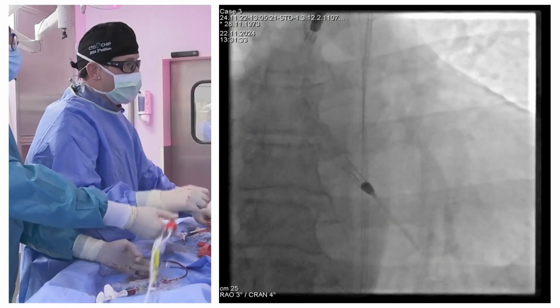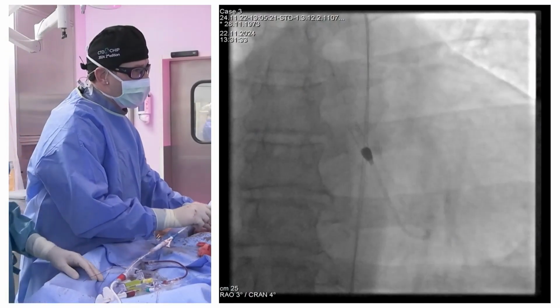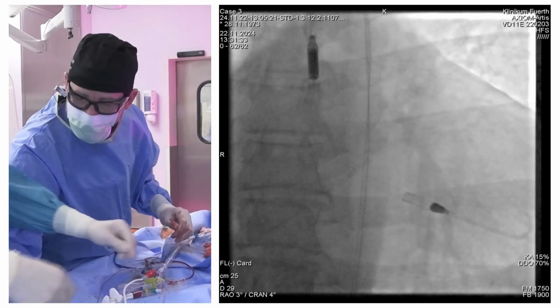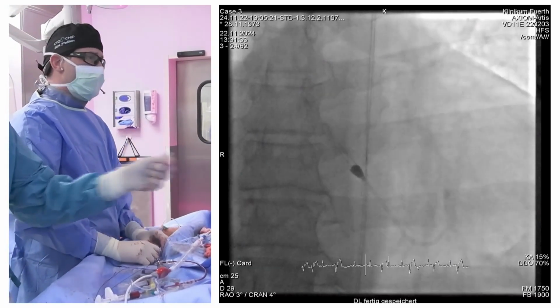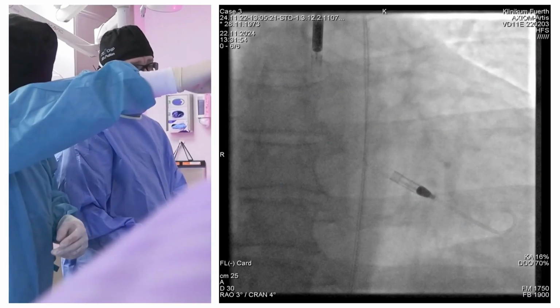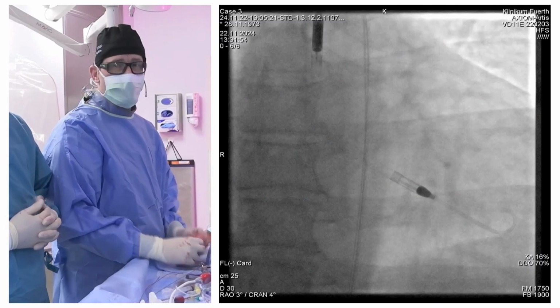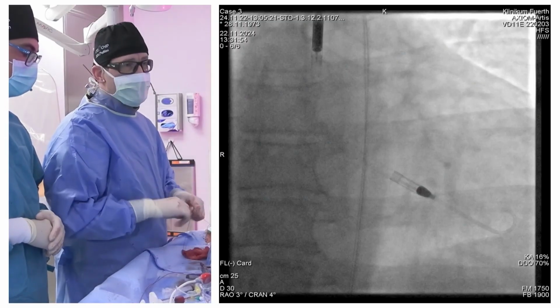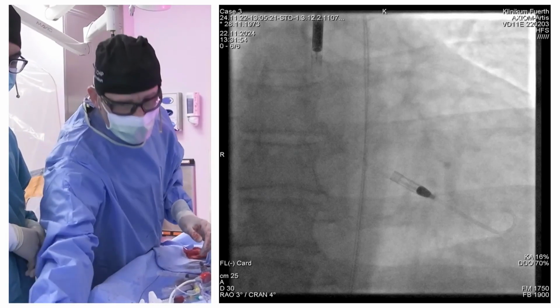Felix, have you heard this comment? Yeah, I heard that. What do you think about it? It's a matter of experience or also personal estimation, either being safe upfront or making smaller steps before. I mean, we have an EDP of above 20 with a 100 systolic pressure. So with four times the LVEDP being larger than the systolic pressure margin, of course you can stage, but first we are here to open the vessel and not to show how to stage a procedure.